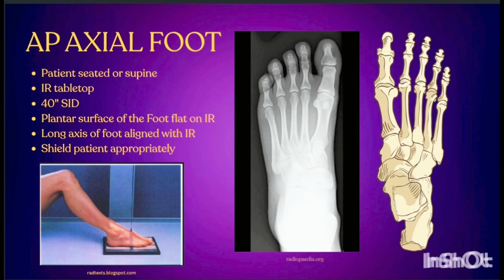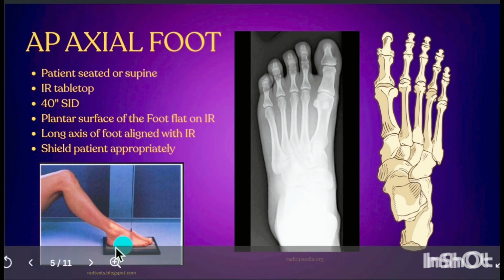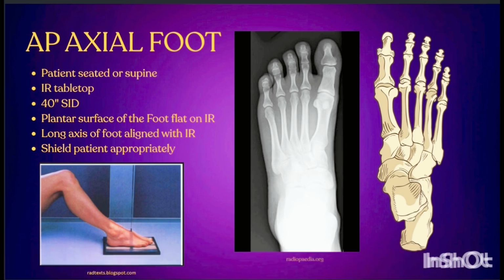So if a patient has a higher arch, when they put their foot on here, you look at their foot and they have a higher arch, you may need to increase your CR to about 15 degrees cephalic. If they have more of a flat foot, then you may need to decrease your angle from 10 degrees down to 5. By doing so, this will help keep the metatarsals perpendicular to the image receptor.